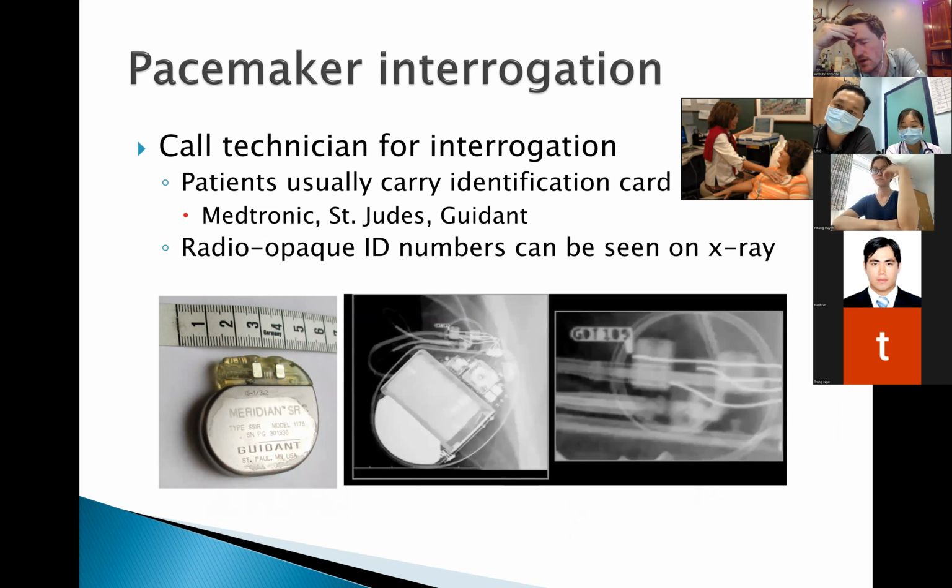Now, when you guys have patients with pacemakers, do you guys have the people either up on the cardiology floor that are able to interrogate the pacemakers for you?